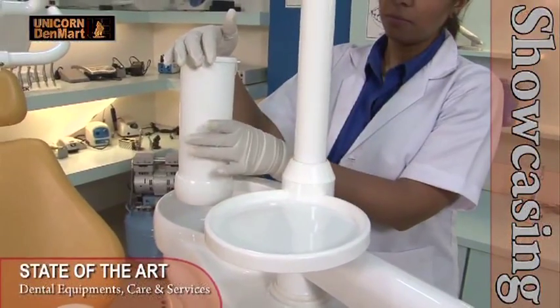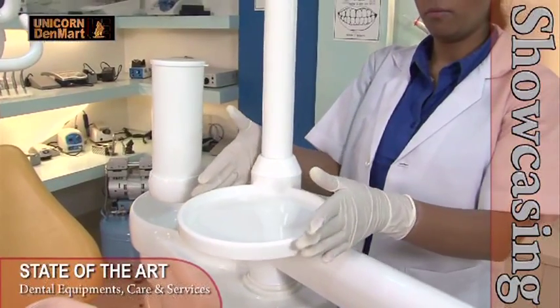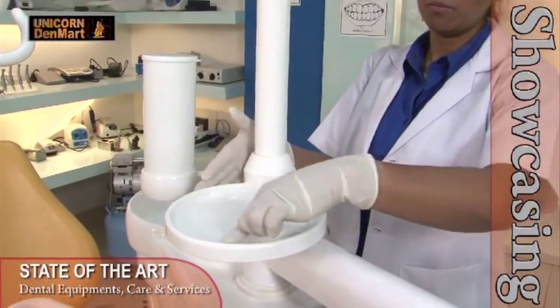This dental unit is well equipped with a set of extra accessories like a glass dispenser, tissue paper dispenser, small utility tray, and buzzer sounds for almost all its operations.